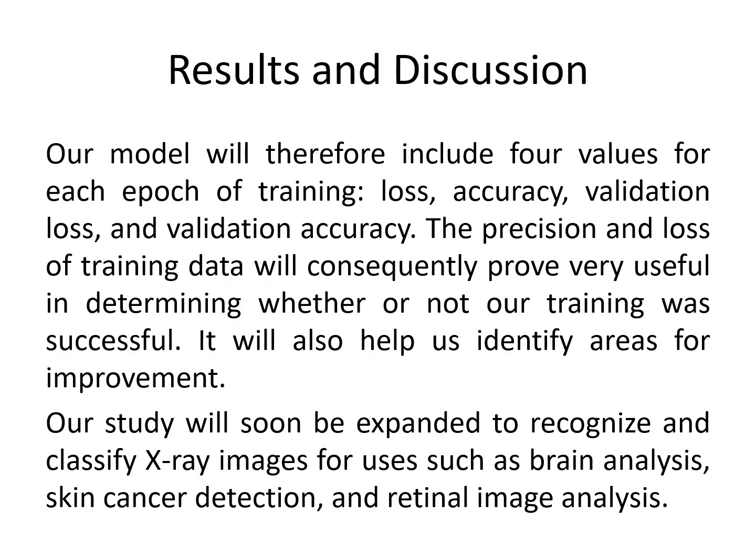As technology influences practically every part of our lives, we developed this method to identify and classify pneumonia for COVID-19. This method begins by reducing the size of the chest X-ray images to a fraction of their original size. A CNN framework is then used to enhance the photos by extracting and classifying image characteristics. Our model's validation accuracy was marginally higher when compared to other approaches.